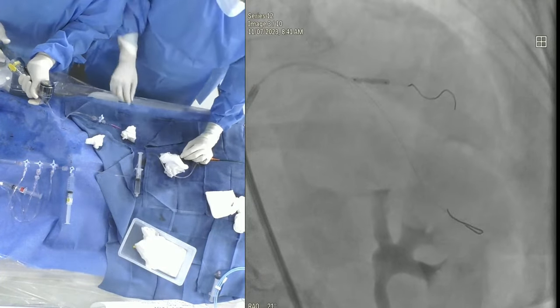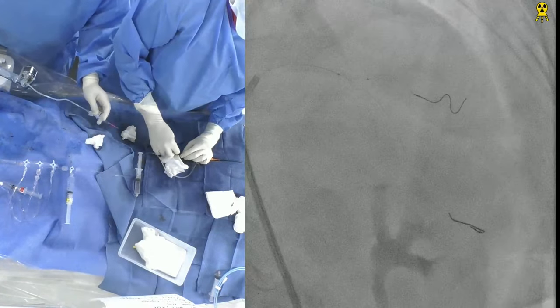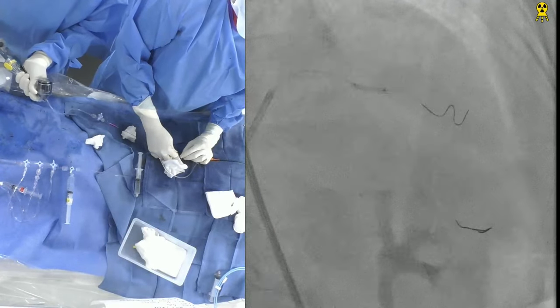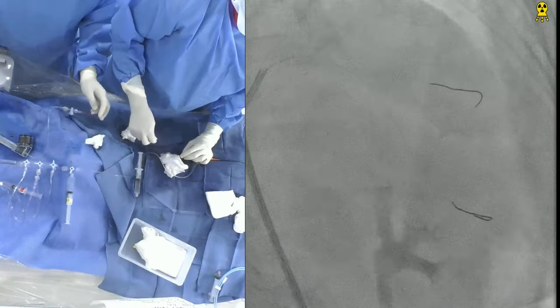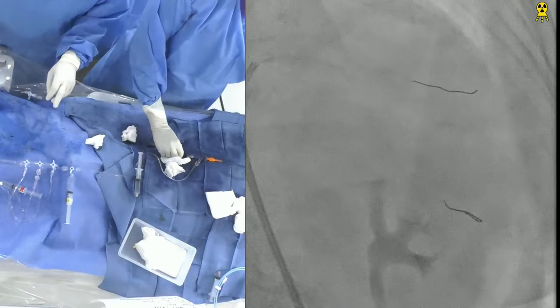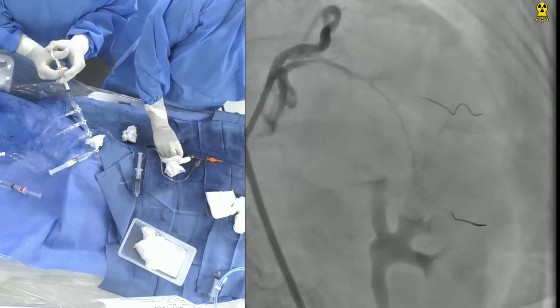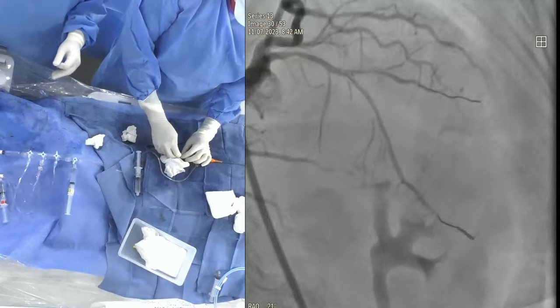Okay, down. Yeah, 16. So what size do you want? 2.5 is good. Too big, I think. Go up. Okay, get us the stent sizes. 2.75, 38. Yeah. Down. And 2.5, 12. Or do you want 2.25? No, I think 2.5, 12 is okay. Take a picture. Too big. Oh, and take another picture. Okay. Longer. 2.25. Okay, 2.25, 18.